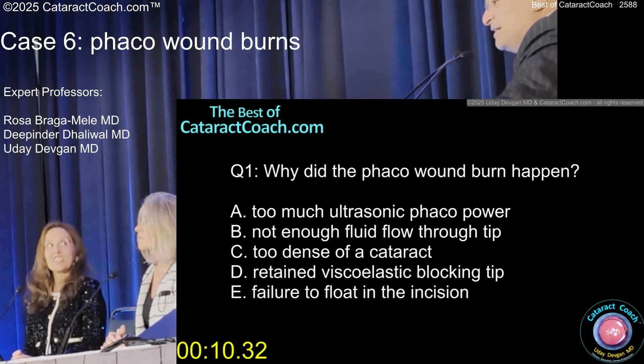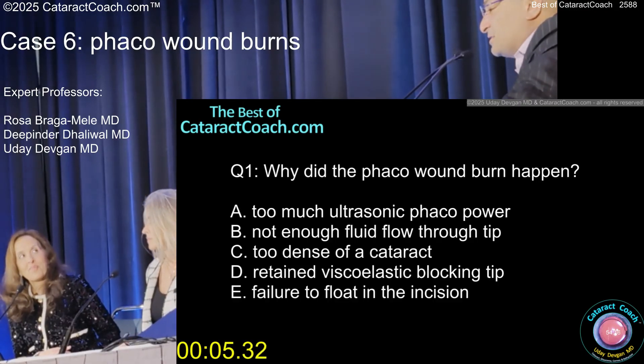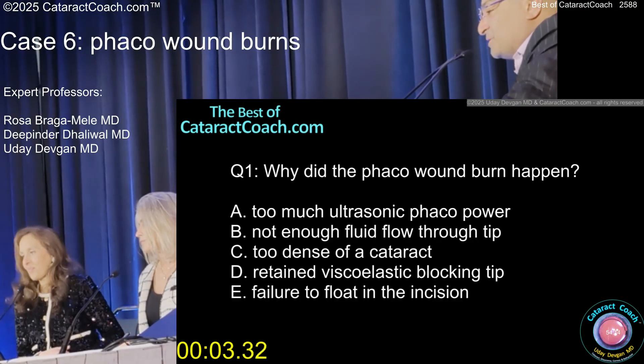Once that happens, you're done. The problem is it's going to leak the whole case. Don't try to recycle and use that incision again — it's just going to leak, leak, leak. You need to abandon it and do something else.